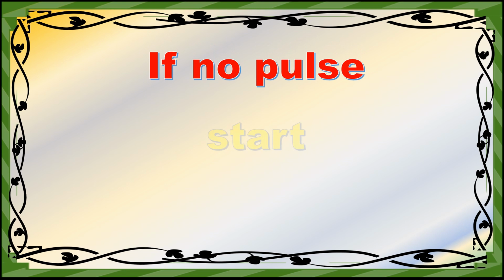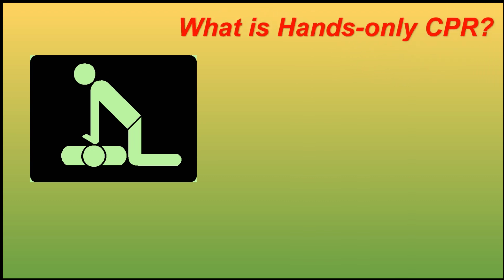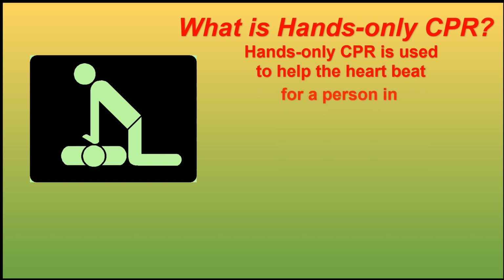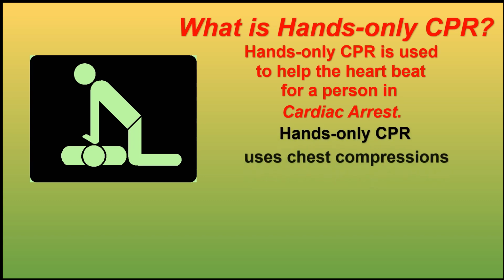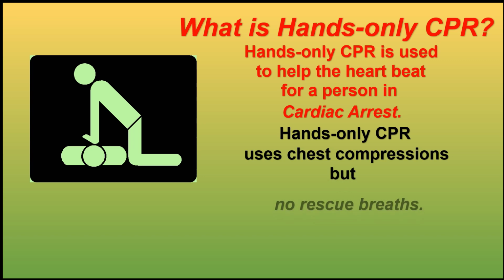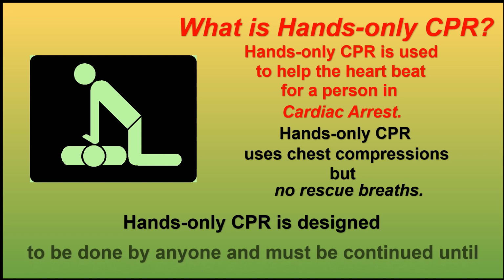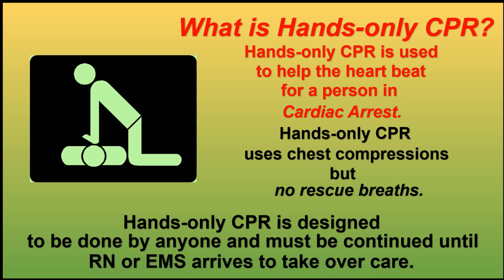If no pulse, start hands-only CPR. What is hands-only CPR? Hands-only CPR is used to help the heart beat for a person in cardiac arrest. Hands-only CPR uses chest compressions but no rescue breaths. It is designed to be done by anyone and must be continued until RN or EMS arrives to take over care.